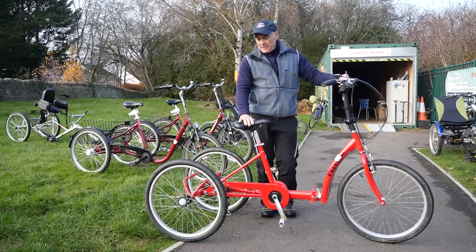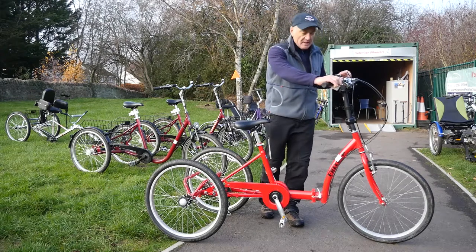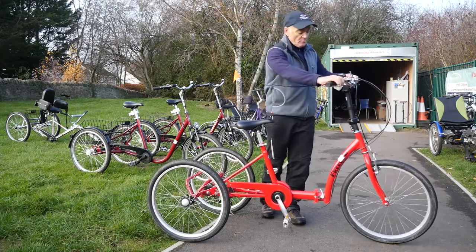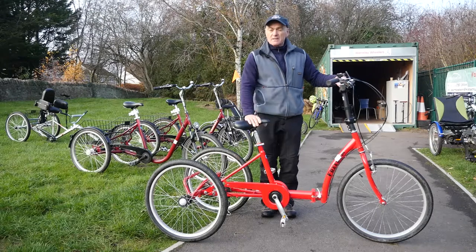This is called a Freedom Trike — it's an adult trike, really for people that can no longer cycle on two-wheel bikes or have never been able to. It's got gears that you change while pedaling, with a simple trigger operation. It's got conventional braking. You really need to be quite independent to use this because you can get quite a speed up.